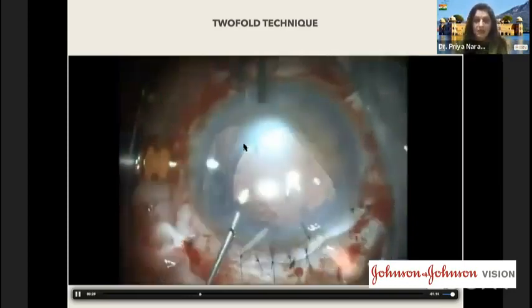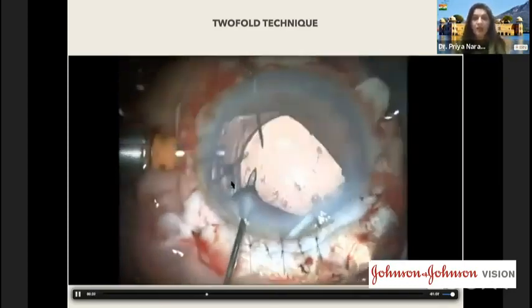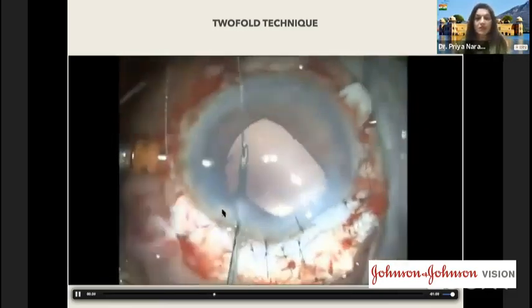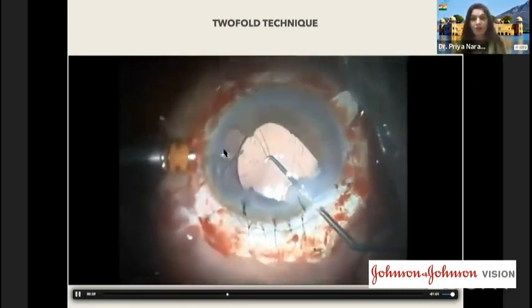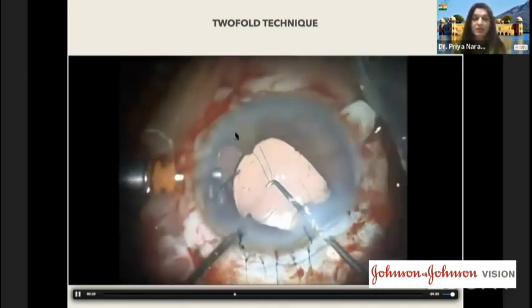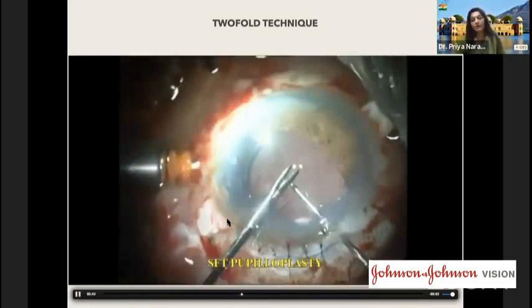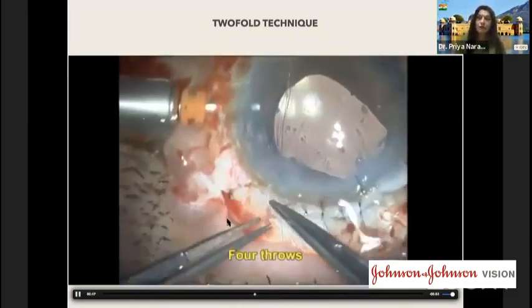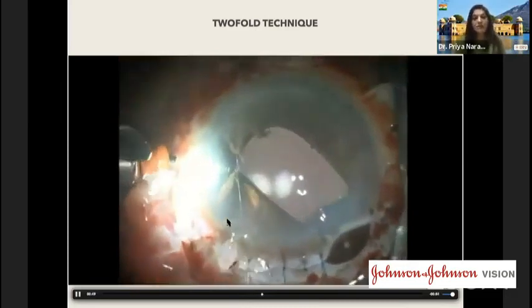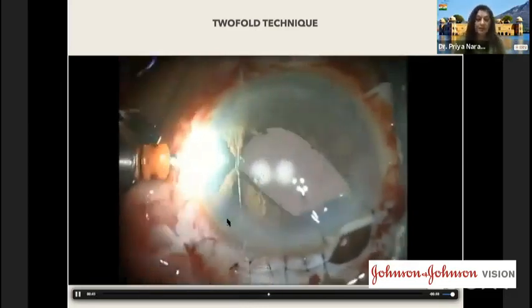Now, what you see here is the irregular pupil. There's a missing iris tissue here because this is a traumatic iridodialysis. So you do not have iris tissue here in this case. So then what you try to do is, in the areas where it is deficient, you go ahead by doing a pupilloplasty procedure. All this said and done, you have to be very careful while doing these surgical interventions because it's a fragile tissue, especially if it is a traumatic case.